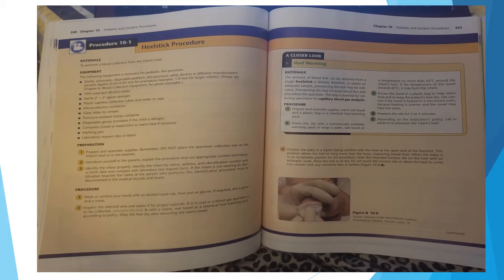Preparation: prepare and assemble supplies. Remember, do not place a specimen collection tray on the infant's bed or in the bassinet. Introduce yourself to the parents, explain the procedure, and use appropriate comfort techniques. Identify the infant properly. Identify the infant by name, address, and identification number and/or birth date, and compare with the laboratory test request form. If the infant is not wearing an identification bracelet, the name of the person who performs this identification procedure must be documented in the medical records and/or chart.